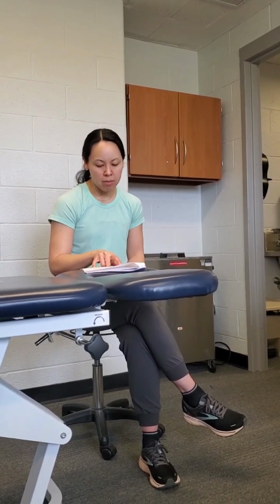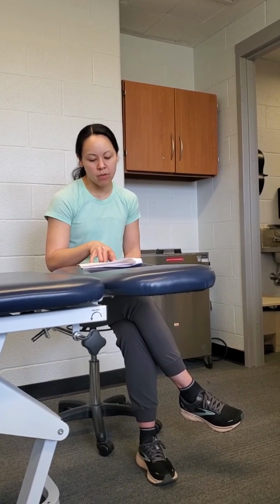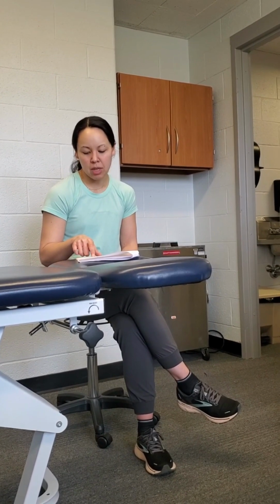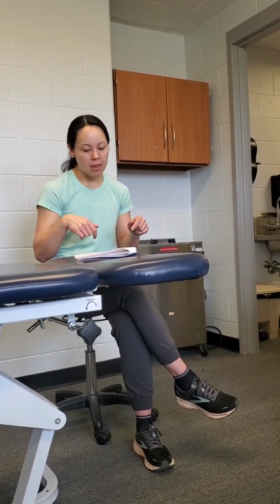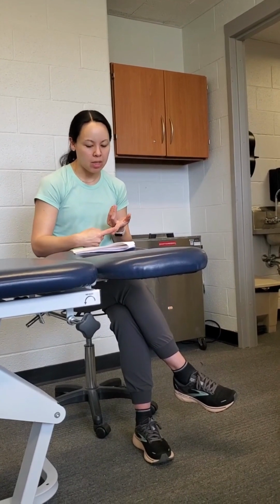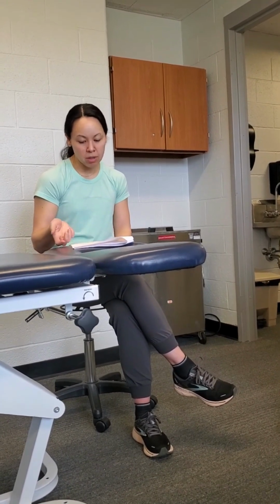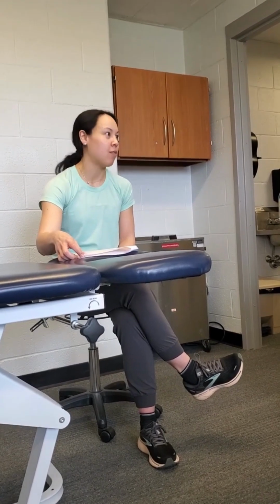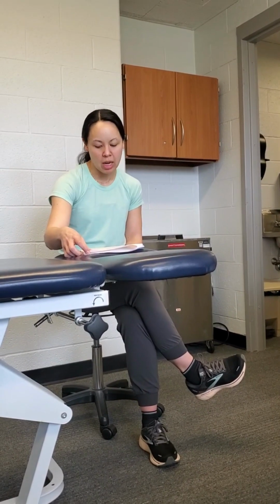in general. So it showed a study of 65-year-old subjects. BFR was performed 3 times a week for 4 weeks at 20% of their 1 RM at 60% limb occlusion. They did bilateral knee extensions, the 30, 15, 15, and then the 4th set was to fatigue. And this basically resulted in better vascularization and a decrease in homocysteine levels, which is good, and it decreased the risk of even cardiac events in this patient population, which was kind of interesting.